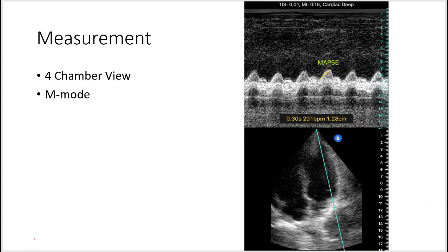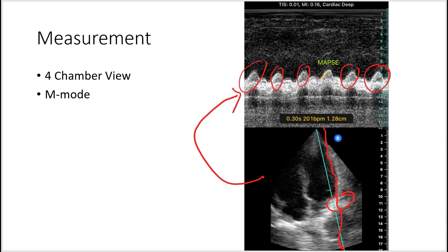To measure MAPSE, you first obtain the four-chamber view, and then you go into M-mode, and then you align the M-mode line against the lateral wall of the left ventricle near the mitral valve area. You will get something like this — here are the displacements or the excursions of that mitral valve annulus area, and then you can measure the slope that's uprisng, and that is your MAPSE.